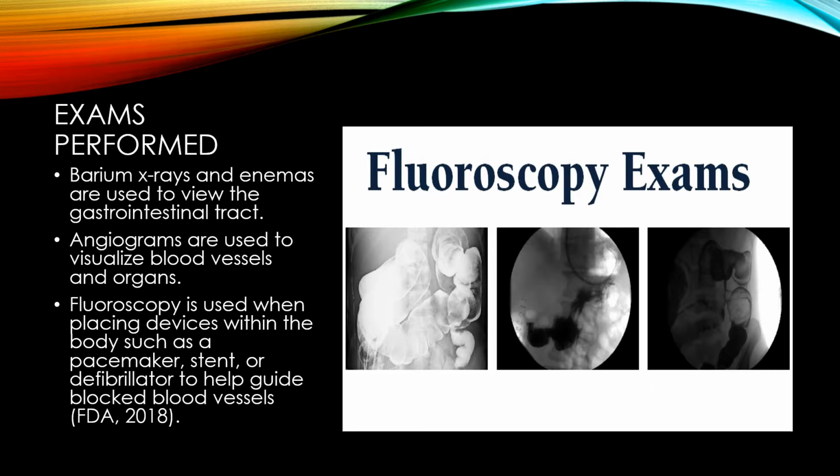The most common types of exams performed in the operating room when using fluoroscopy are ortho procedures, transplants, pacemakers, stents, or defibrillator to help guide the blocked vessels. If a patient were to start bleeding during a procedure, the fluoroscopy would be able to detect where the bleed is coming from actively.